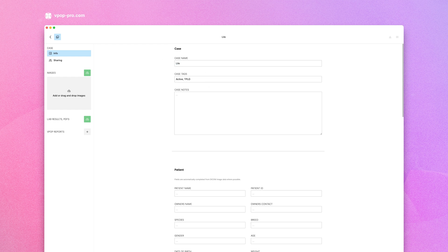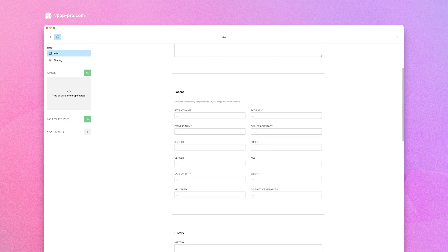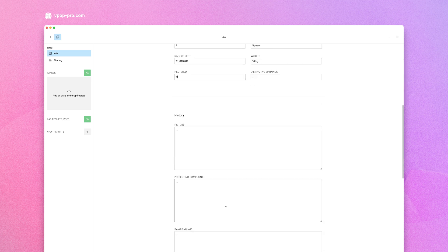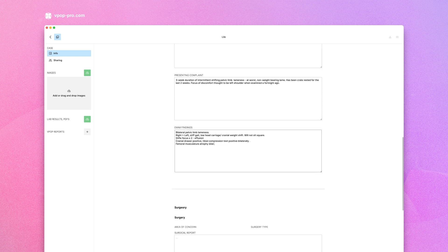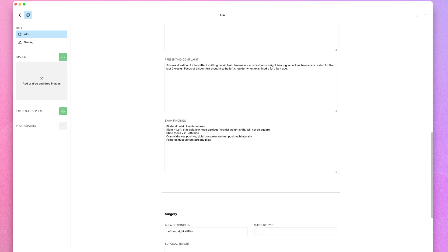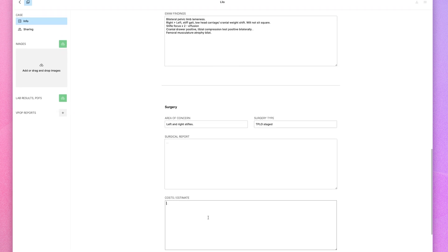Fill out all the relevant information comprehensively, especially if you plan to share this case. Whether you're referring the case with a surgeon or the surgeon yourself, providing detailed information is key to effective collaboration.